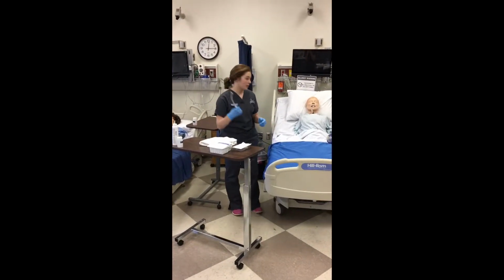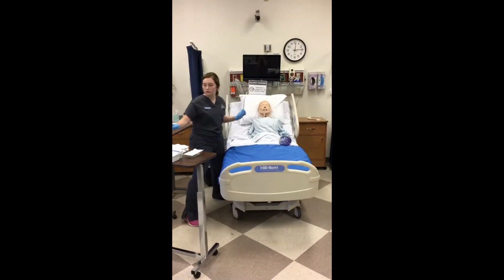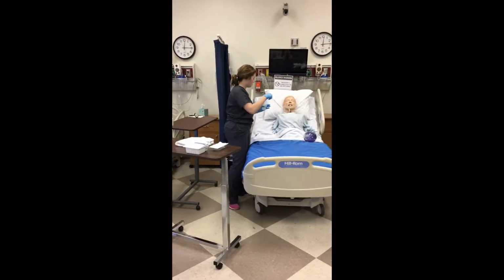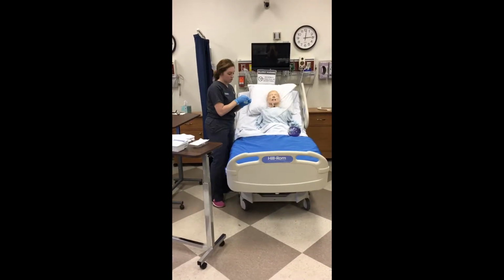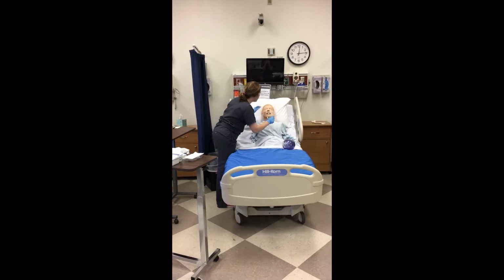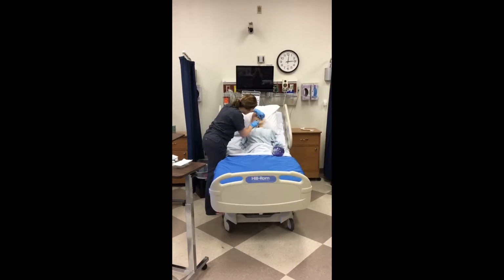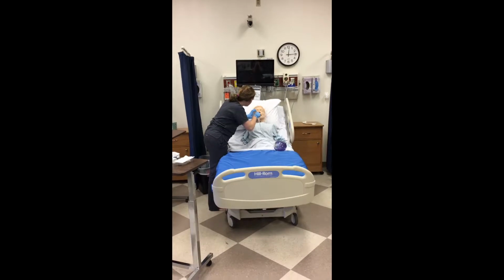Going to grab my yankauer, attach it to my suction tubing. Going to moisten the tip. And I'm going to insert it into the patient's mouth, making sure that I'm on the outside of the teeth, staying close. You don't want to suction any of the soft tissue.